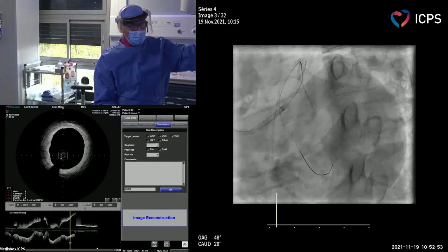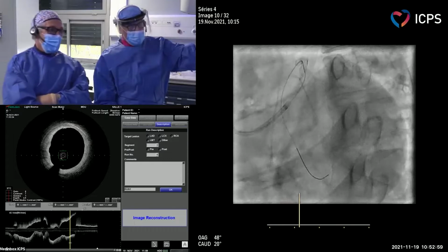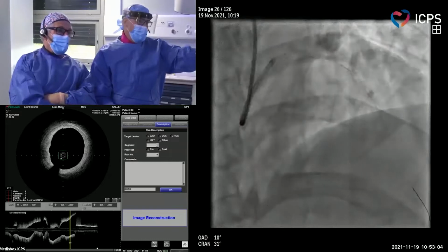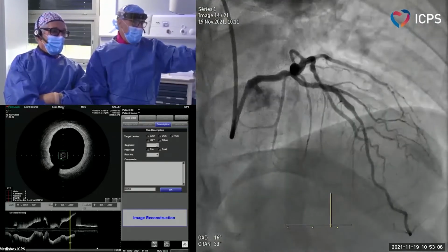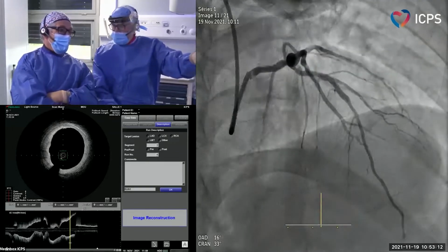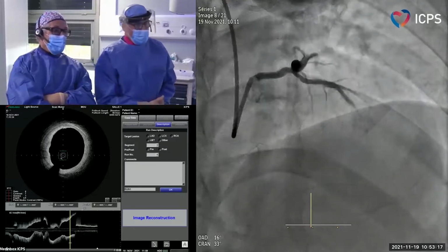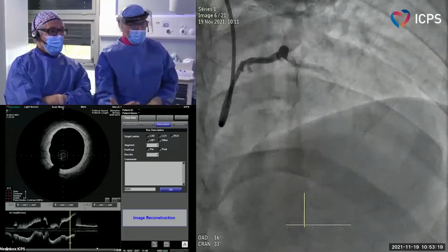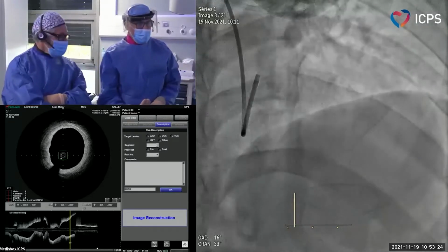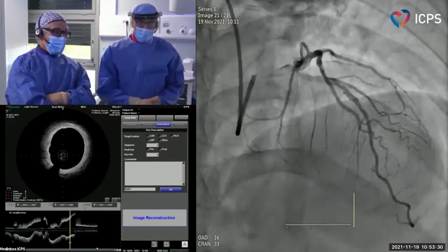and have a good result on this bifurcation. Even if the angulation between LAD and circ is okay, you see in the view shown that it will be hard to put a stent only on the ostium of the LAD. Yeah, of course. It's really risky, and if the stent is misplaced too far, you will not cover the ostium. If the stent is too proximal, you will be in the distal part of the left main, and the angioplasty will become very complex.